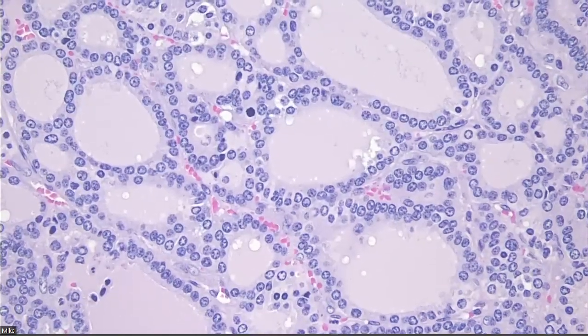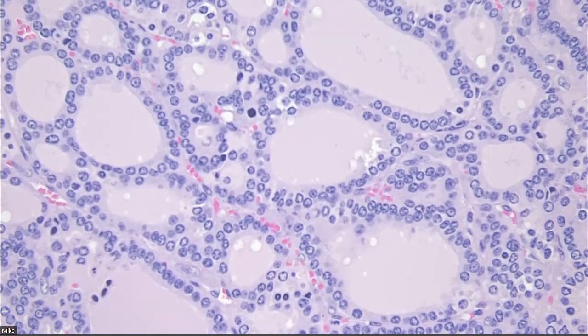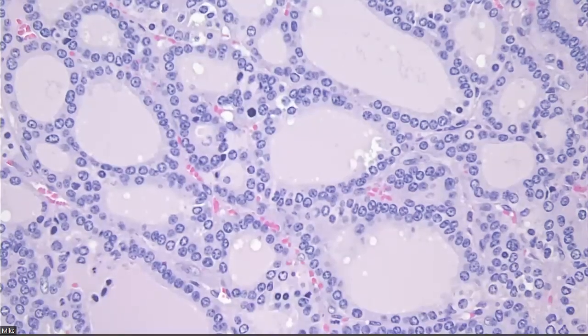So what does high grade not have versus poorly? What Turin criteria does high grade not fulfill? Oh, so the Turin criteria that high grade does not fulfill is solid growth. Okay. So you can have solid growth in a high grade, you don't need it. You need either necrosis or mitosis. You need solid growth for Turin. You don't need solid growth for high grade.